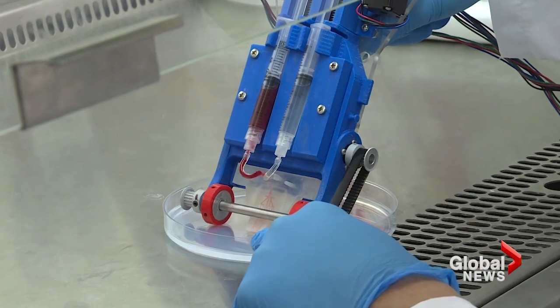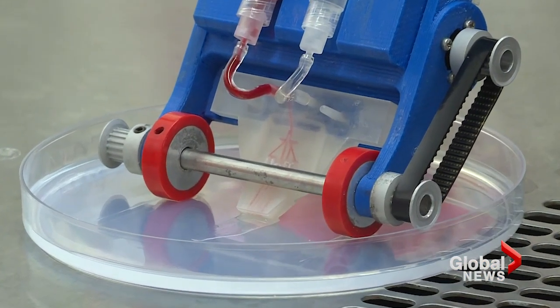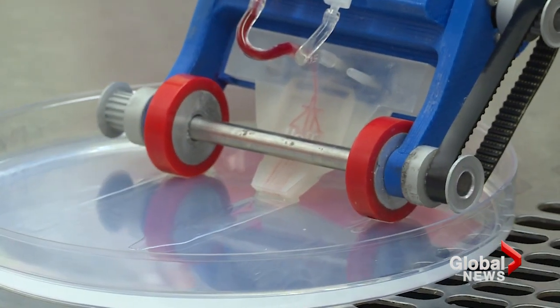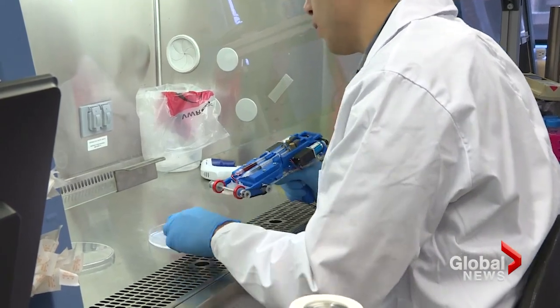We've done a lot of testing. We started with physical characterization in our engineering laboratories, proving that we can consistently deposit sheets and achieve geometries similar to physiologically relevant skin layers. We've proven that we can add cells, work under sterile conditions, and more recently apply this in vivo to actual wounds at Sunnybrook Hospital. We've come a long way.